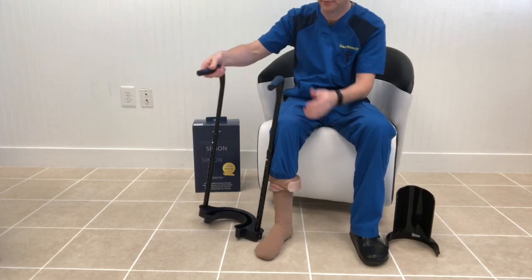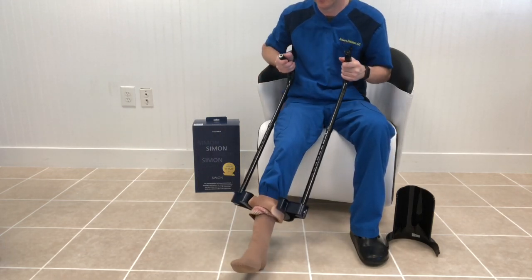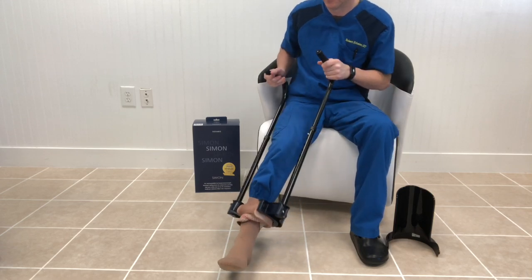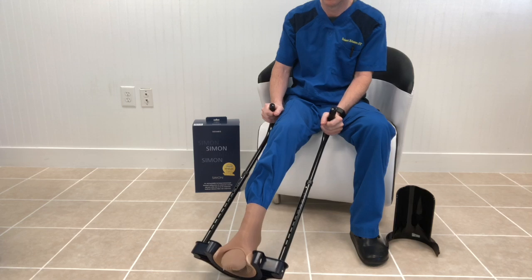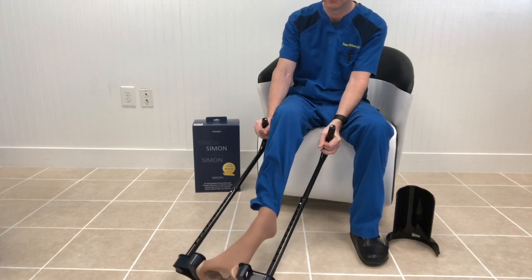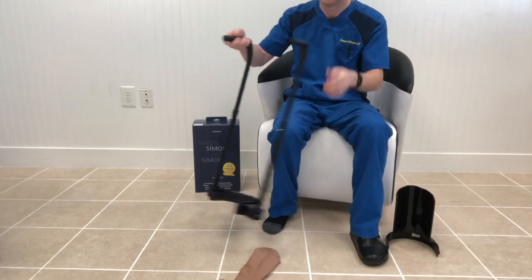Here too, you want to make sure you pull it down as far as you are able to comfortably reach. The more fabric you can, the further down you can push it, and the easier it will be to pull your sock out. You have less length of fabric to try to push away and pull out of.